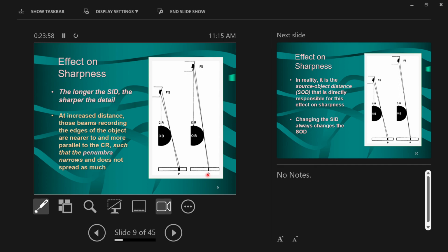If you're an X-ray tech student and you haven't turned on a flashlight and played with shadows yet, you need to. Everything that shadows do with a flashlight, the X-ray tube does with body parts. It's the same things happening: sharpness, magnification, exposure even. The flashlight is brighter on my hand when it's closer and dimmer when it's further away.